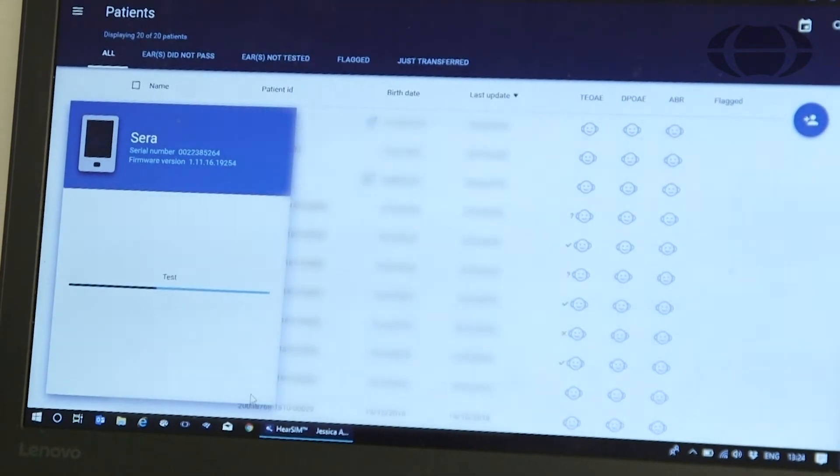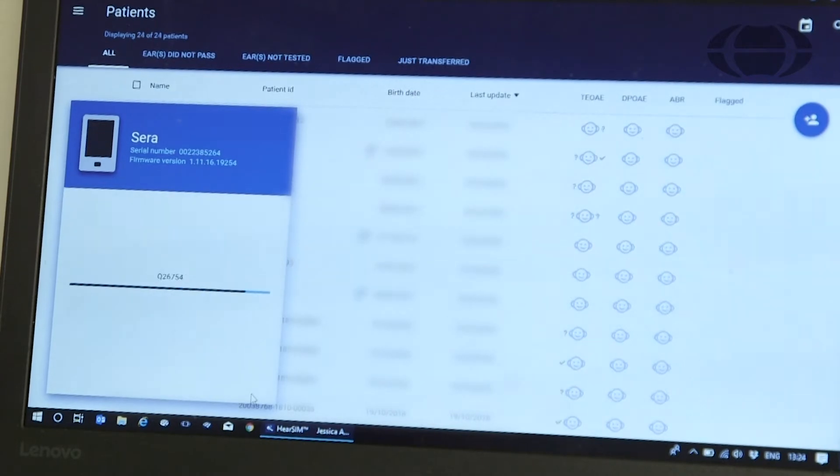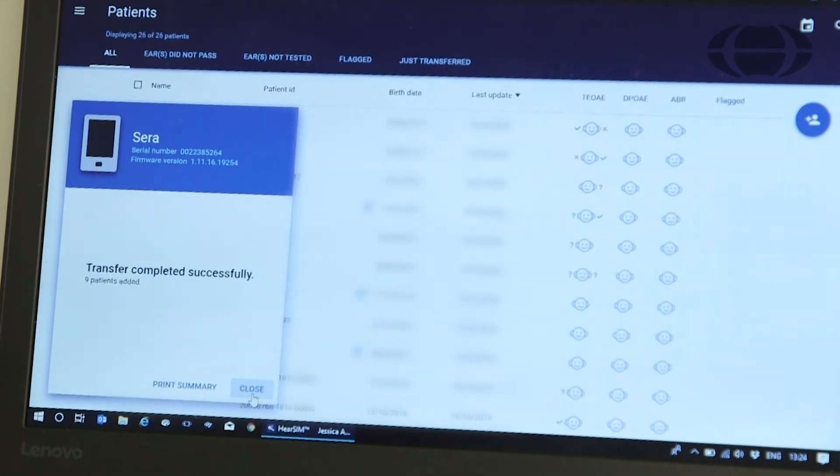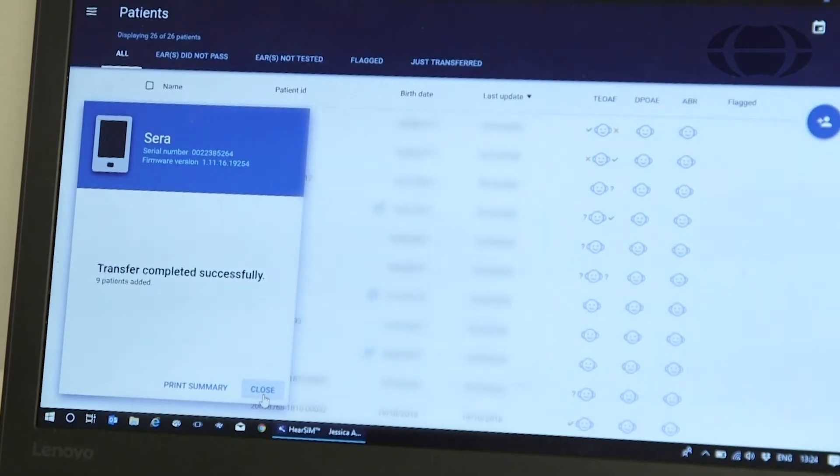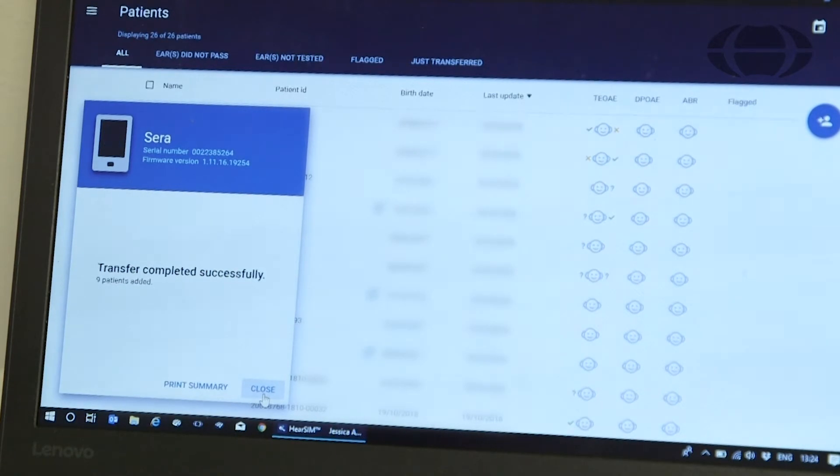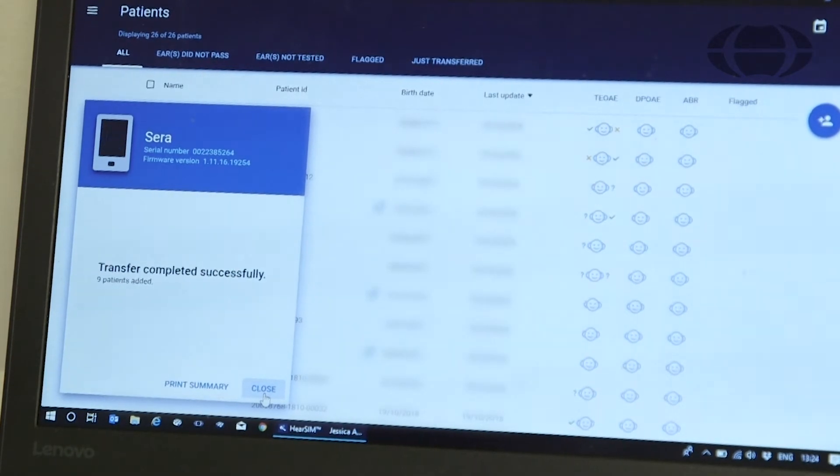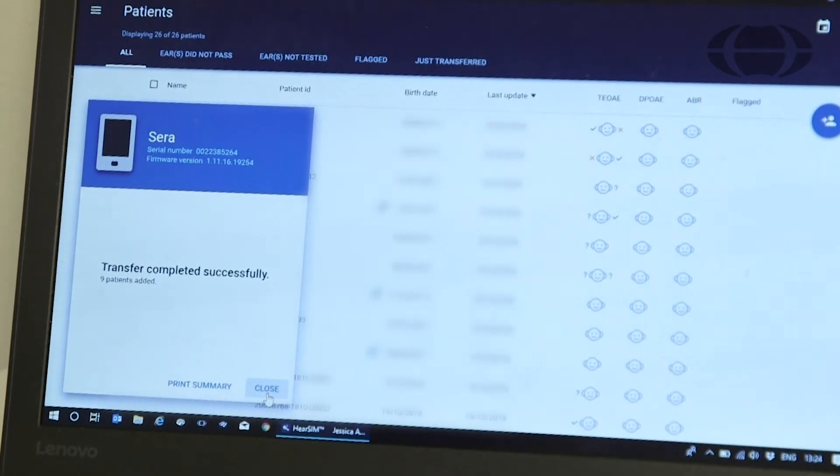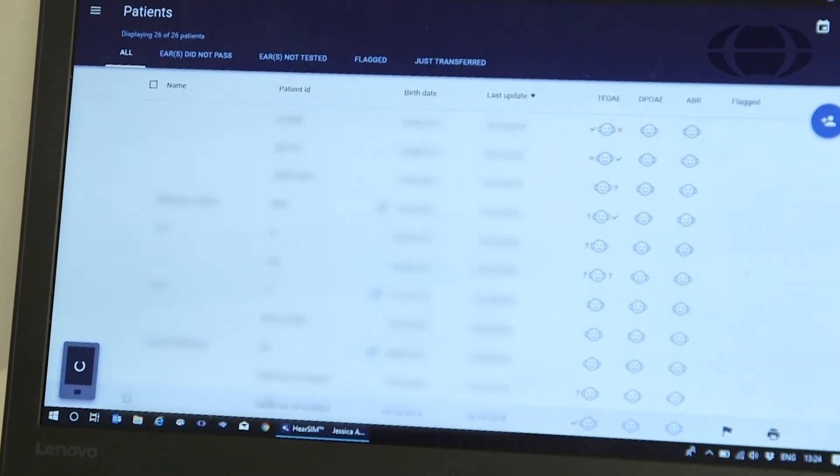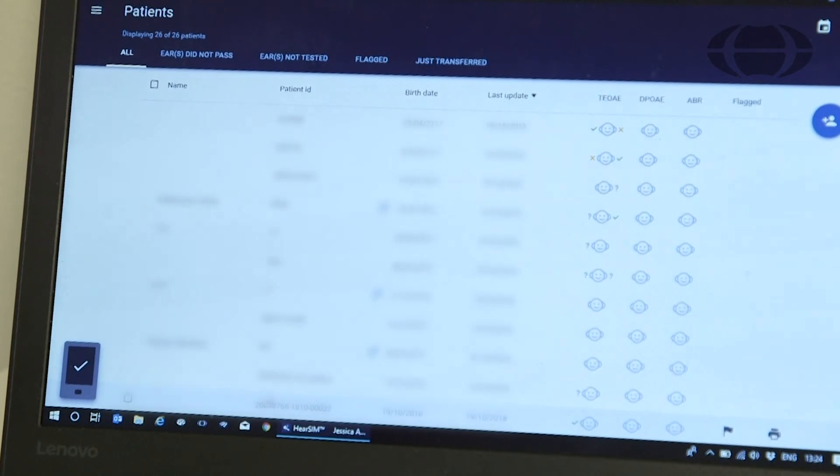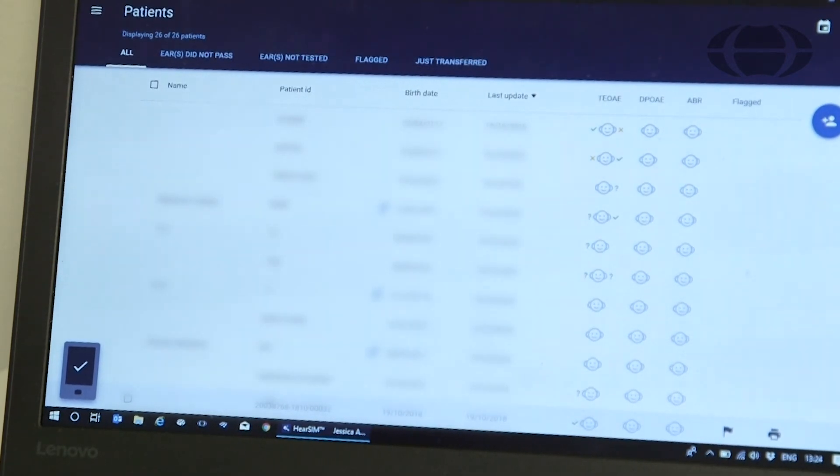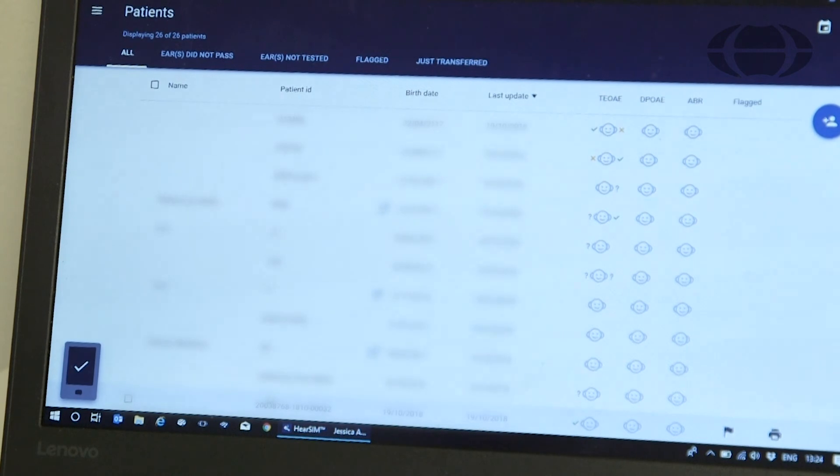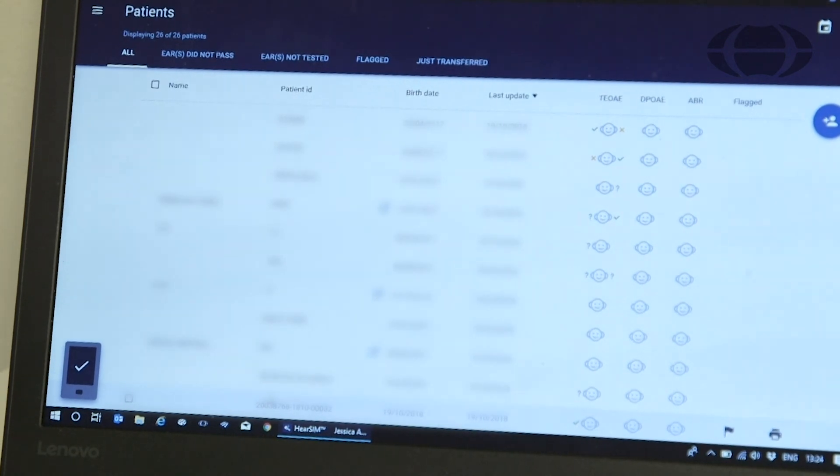All the tests from the device will be imported to the hearSIM database. You will be advised when they have been transferred successfully, and you can press close. Now all the patient data from the device has been transferred to your database, and the device is empty and ready for more testing.